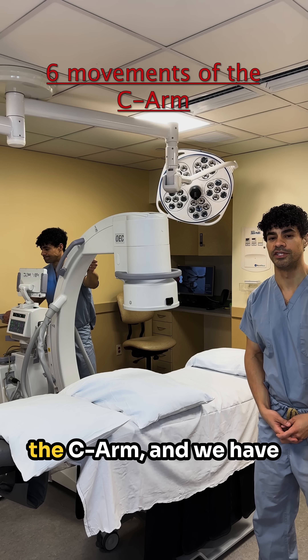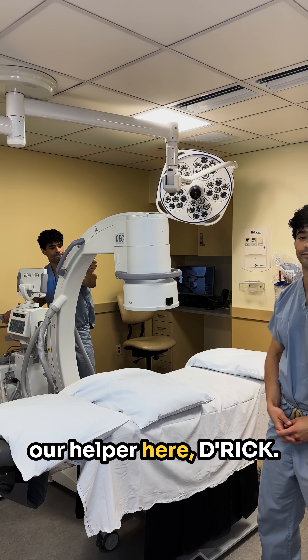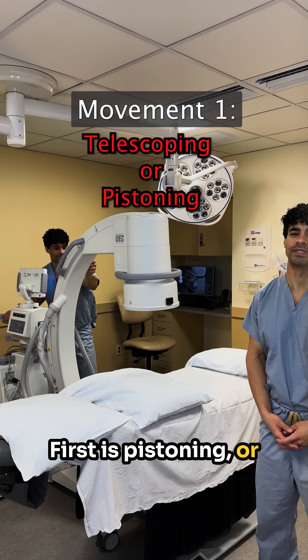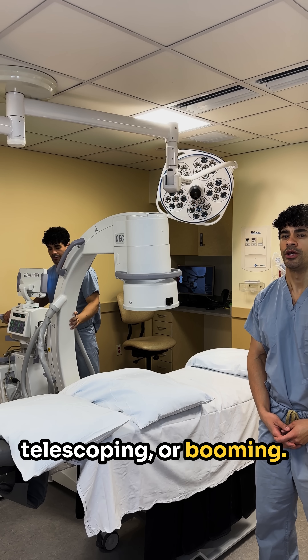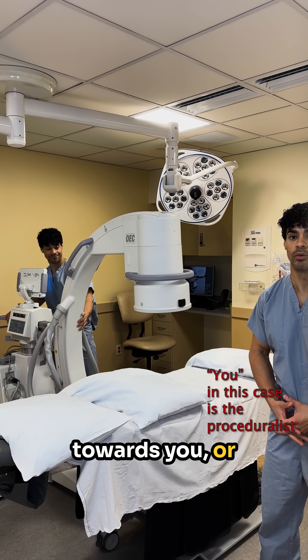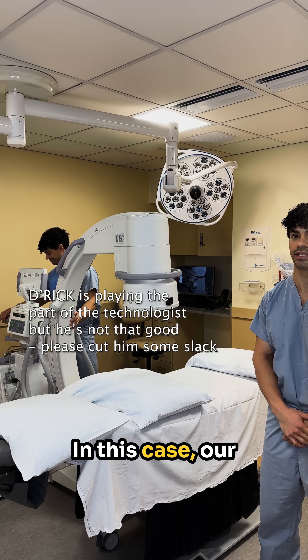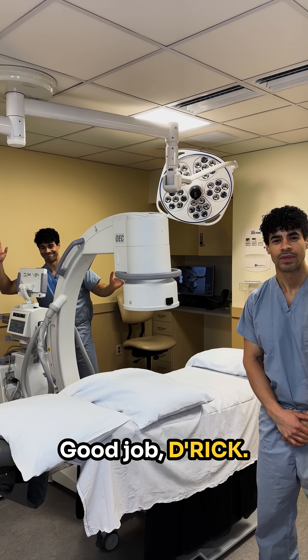The six movements of the CR. We have our helper here, Drick. First is pistoning, or telescoping, or booming. You can boom in towards you or boom away from you towards the technologist — in this case, our helper Drick. Good job, Drick.